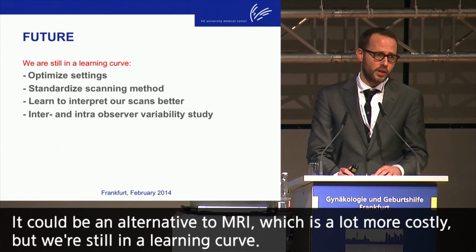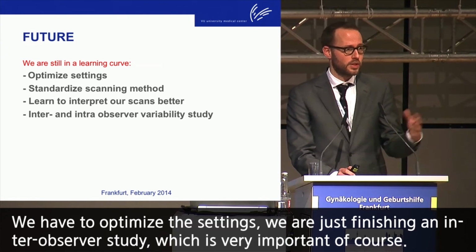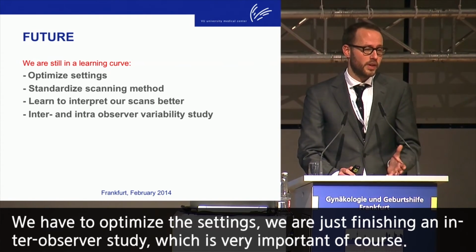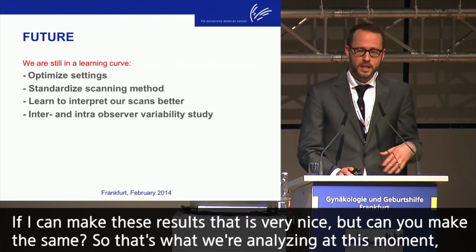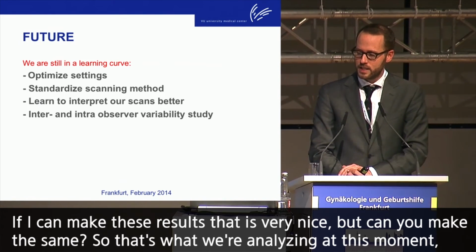But we're still in a learning curve. We have to optimize the settings. We're just finishing an inter-observer study, which is very important, of course. If I can make these results, that's very nice, but can you make the same? So that's what we're analyzing at this moment.